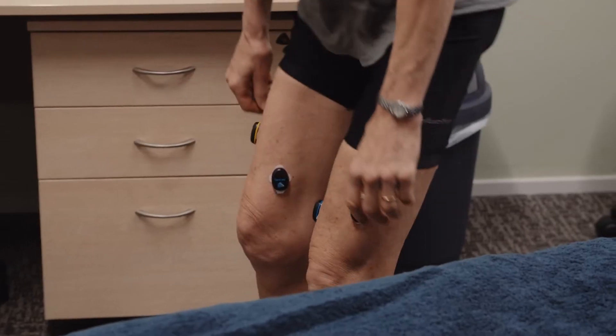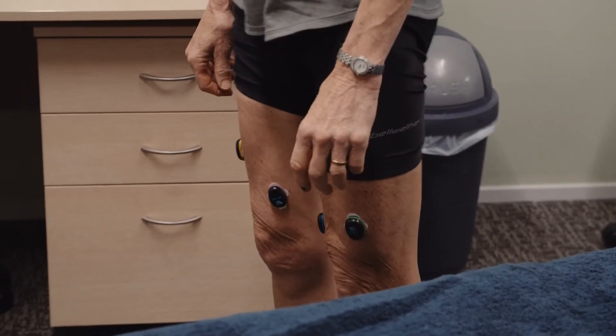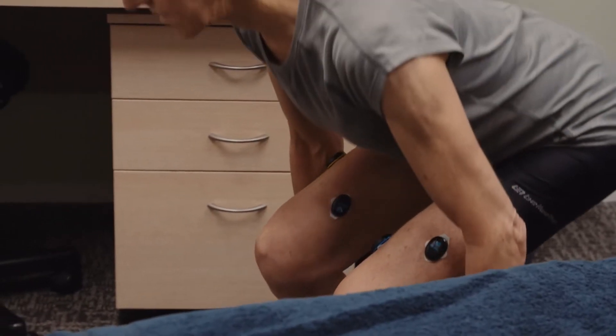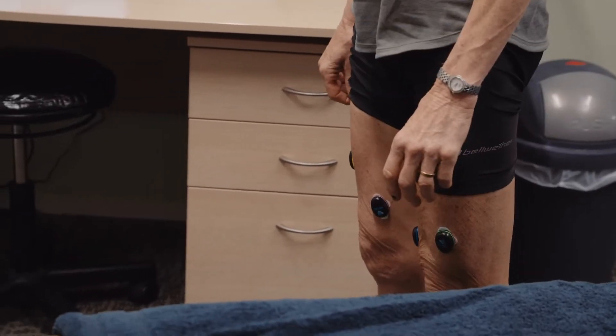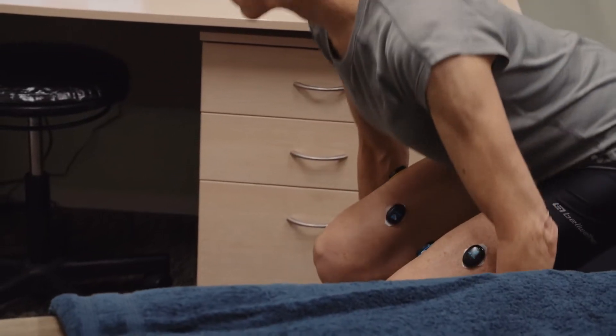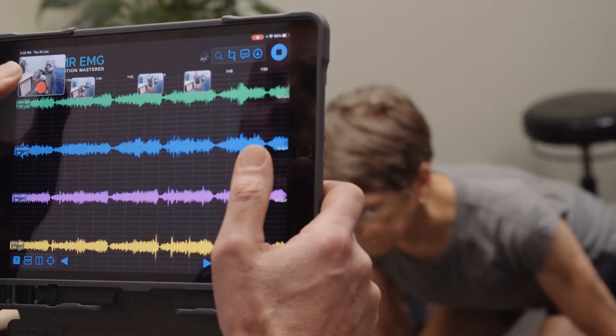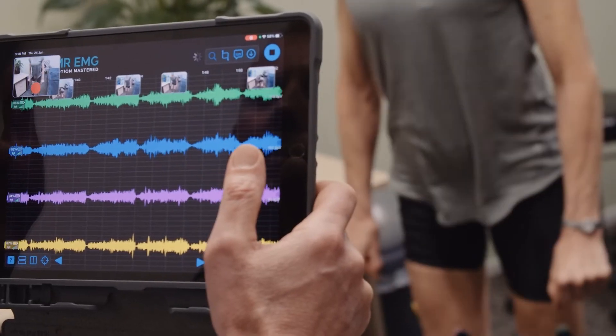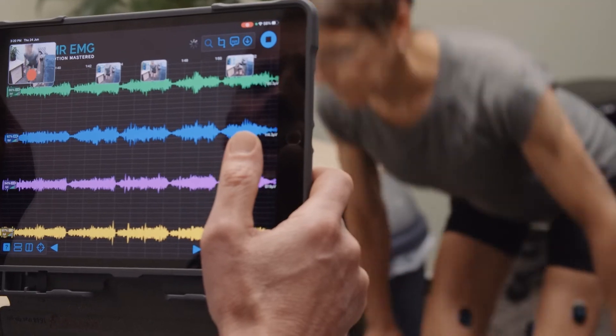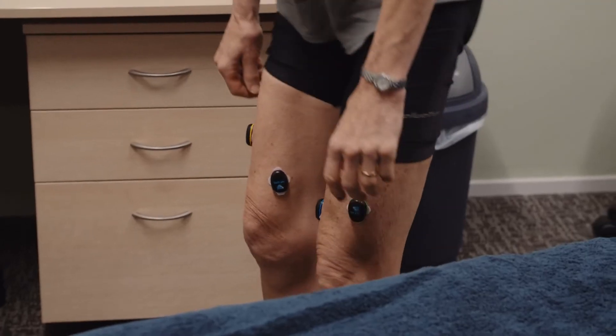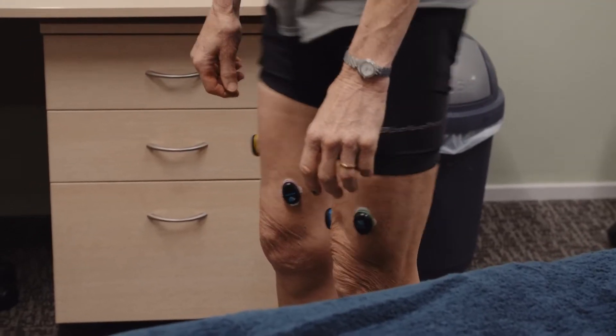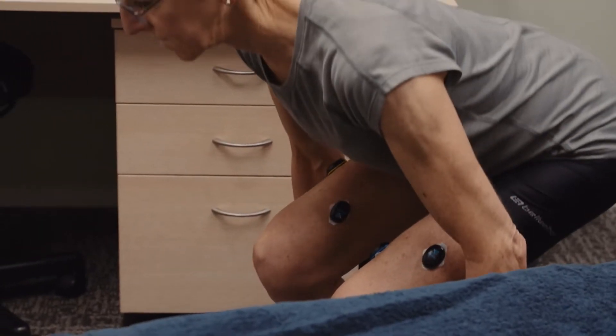Now assess quadriceps muscle activity performing exercises. We will start here with body weight squats. Observe the visual EMG biofeedback, looking for apparent discrepancies between muscles.